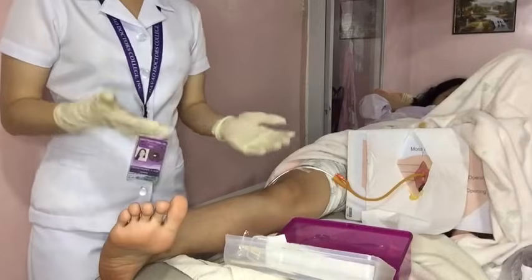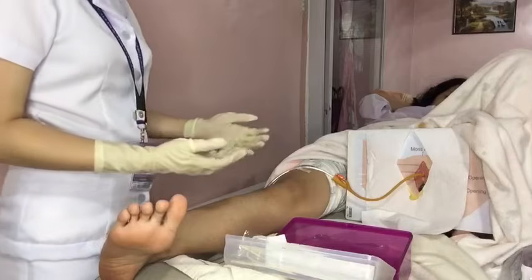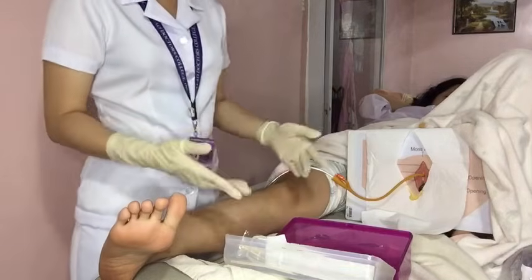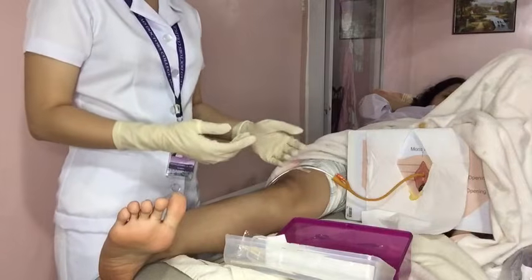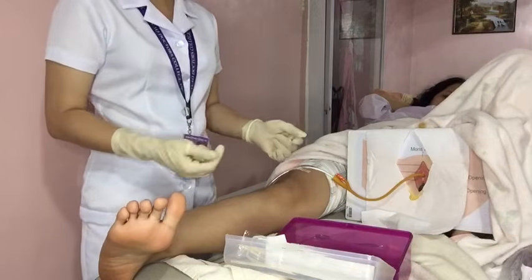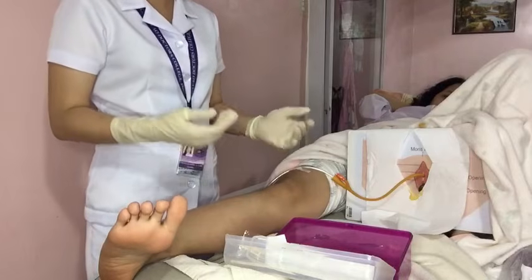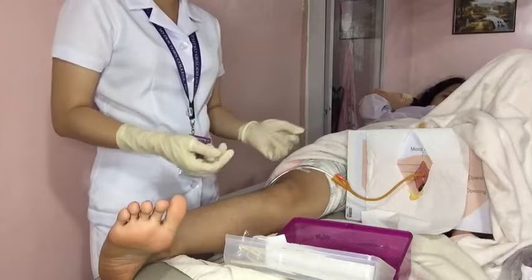Now let's do the aftercare. Afterwards, we need to place the patient comfortably and clean all the equipment thoroughly immediately after use, because secretions, lubricants, and other substances are removed more easily when they are not coagulated.